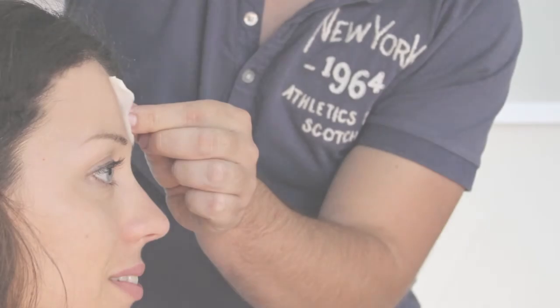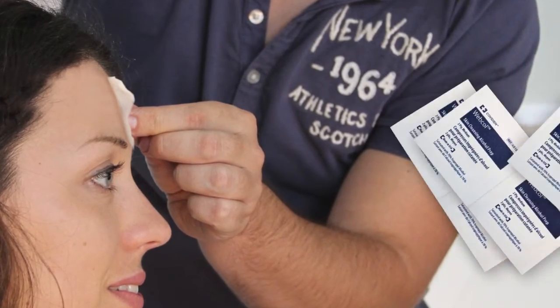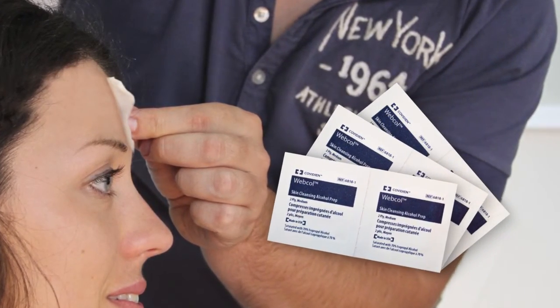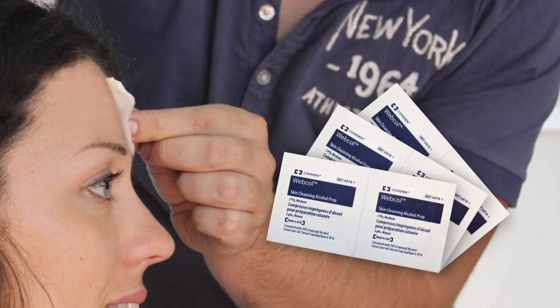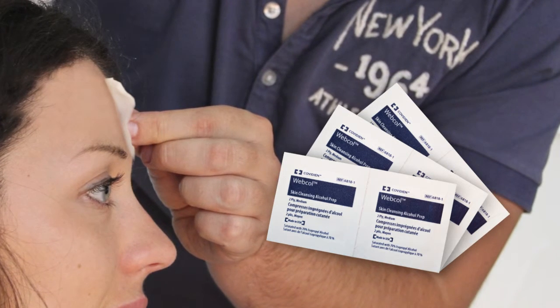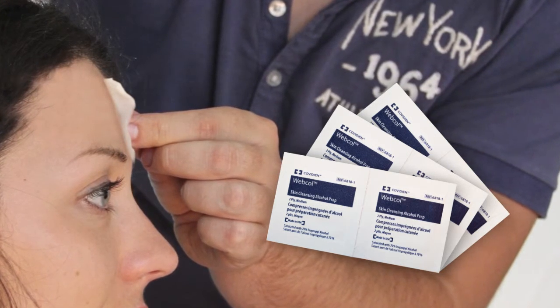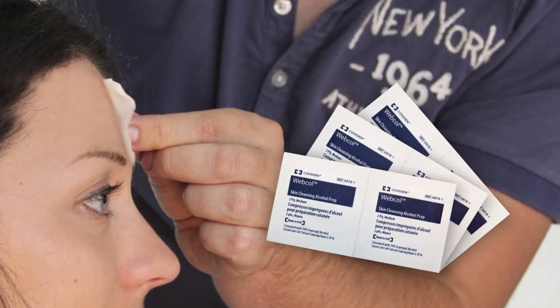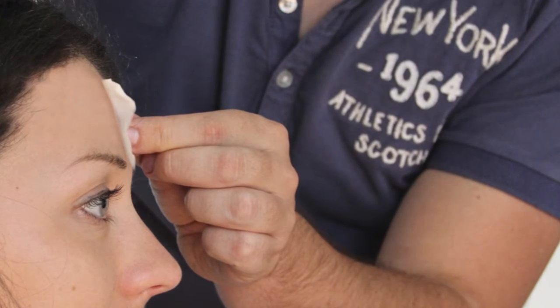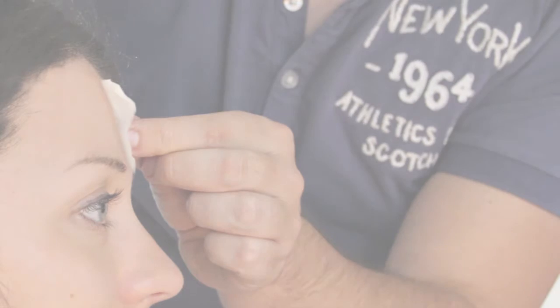Remove makeup and oiliness from the forehead for FP positions and behind the ears for M1 and M2 positions. You can advise the subjects or patients to avoid using hair conditioner in advance of the recording. The use of an oil-based hair conditioner can slightly alter EEG test results.